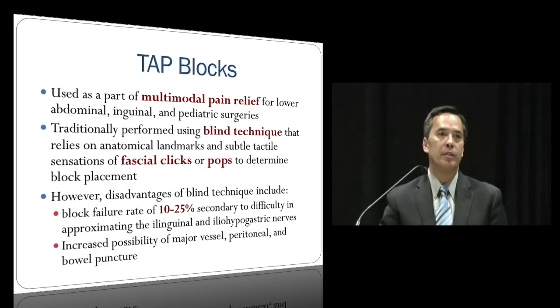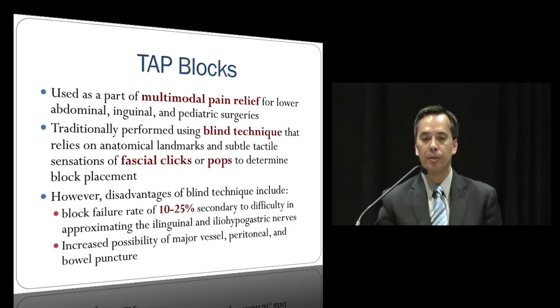And there's also the increased possibility that you might go too deep and you might hit the wrong vessel. So you could have major vessel injury, peritoneal injury, and also bowel puncture.